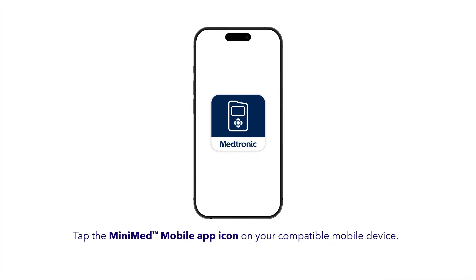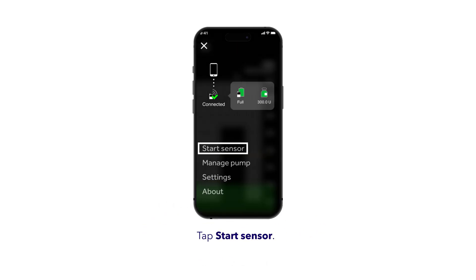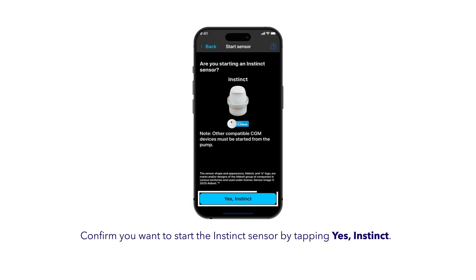On your phone, open the MiniMed mobile app, tap the menu button, then select Start Sensor, and confirm Yes Instinct.